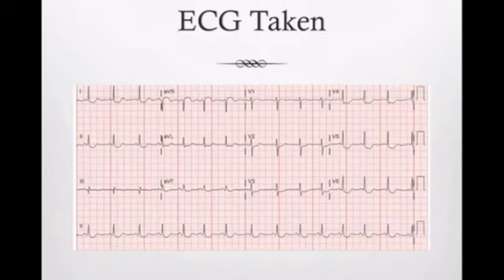All right. So looking at this EKG from a standard paramedic student perspective, we've got no axis deviation. We see maybe some depression. All right. Skipping over AVR because that's what people tend to do. We've got ST segment depression here throughout the precordium. Well, this is a non-STEMI. We've got some T-wave abnormalities, so maybe we're going to take the patient to the hospital of their choice, maybe even bypass to a cardiac center.